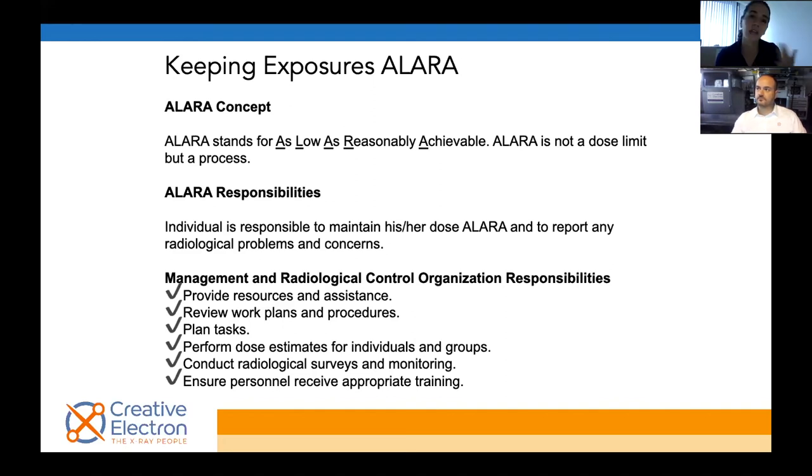So what are the things that I can do to mitigate the risks that could potentially come from an X-ray machine? What can I do to make sure that me as a certified user of the machine and everyone in the room, even the people that might not be in that same room, just like the room next door in an admin position or whatever, what do I have to do to make sure that everyone is safe and this is not a safety hazard for anyone?